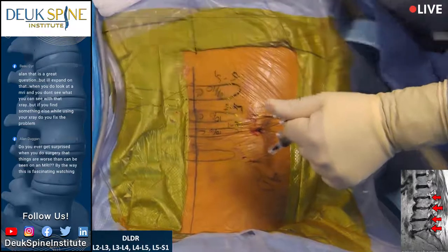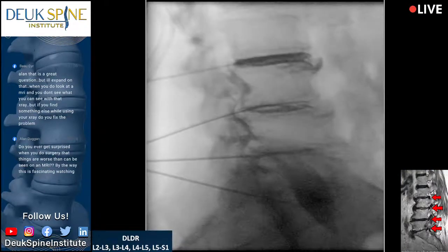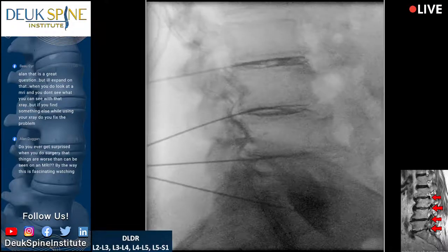How bad is that on a scale of 1 to 10? Ten. Is that where you get your back pain? Yeah, right there. All right, well, I'll suck some of the dye out. Let's see what we got. All right, good. All right, let's get an AP, and then we'll go back to a lateral.